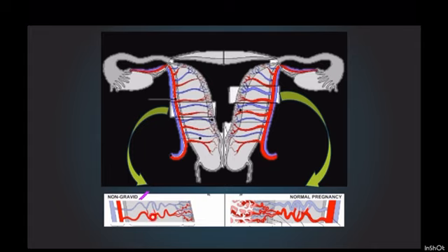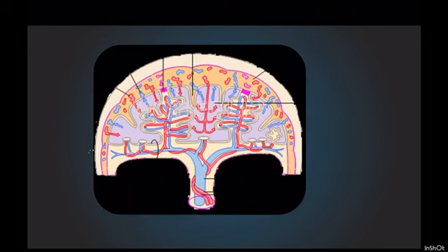Now let's see here. In the non-gravid uterus, you can see that the entire branch from the uterine artery like arcuate, radial, basal, everything is narrow. There is no dilatation in the spiral artery. Here in the normal pregnancy, you can see that it has formed a wide channel at the end, grossly dilated, and even the other segments are dilated. But this forms a wide channel. We will see about that in detail again.